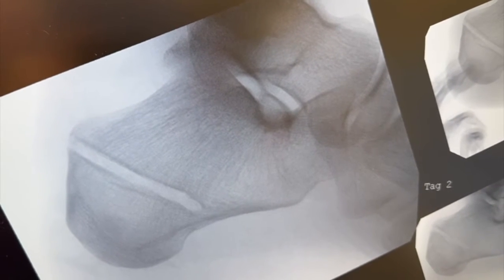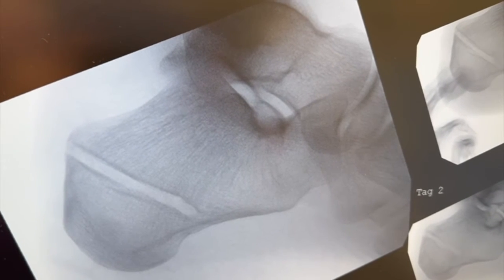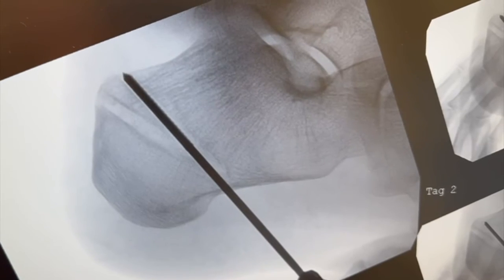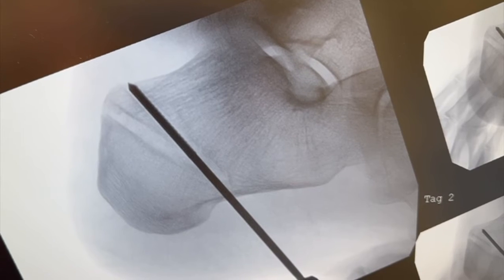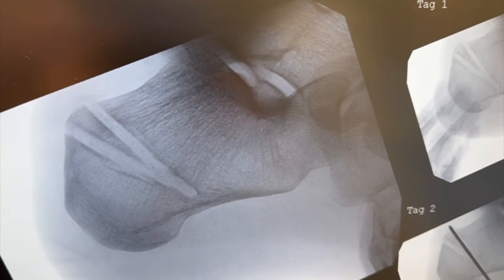The burr is 3 millimeters in width, so I'll move about two burr widths anterior from this initial limb. Here you can see I'm making the second limb of the calcaneal Zadek osteotomy. We've now completed both limbs.